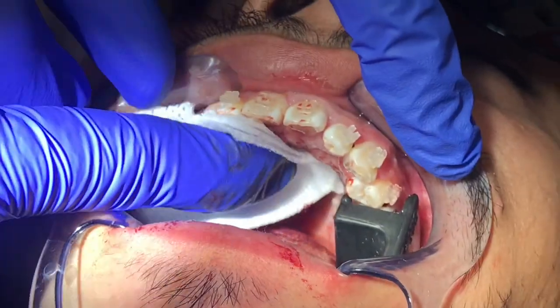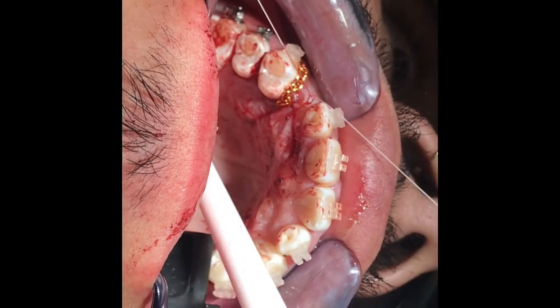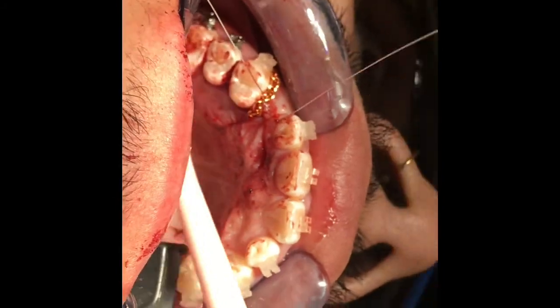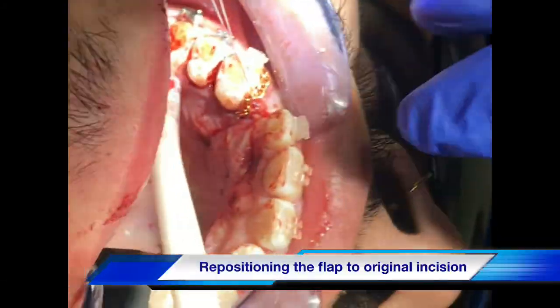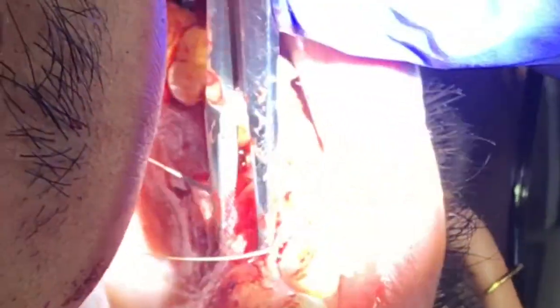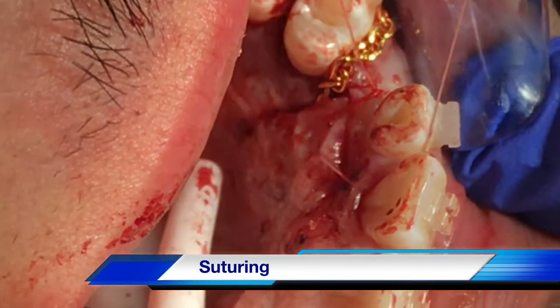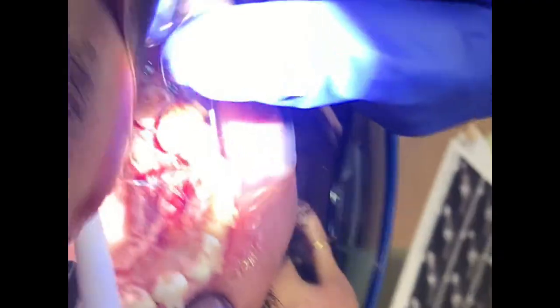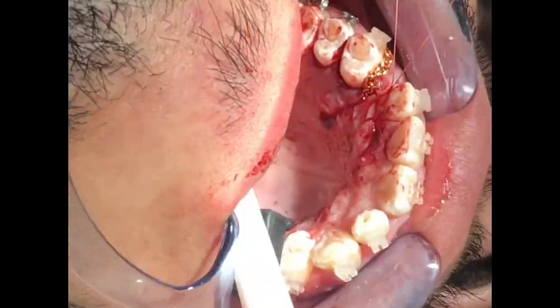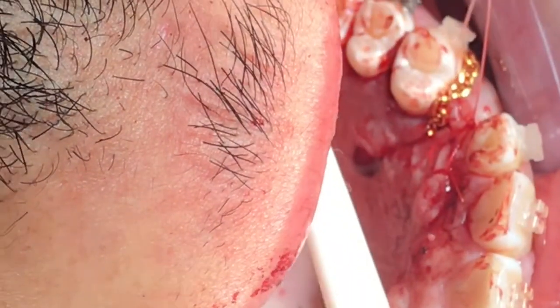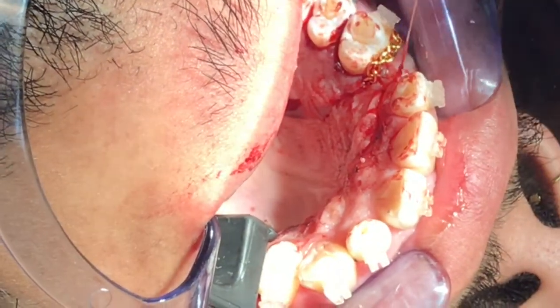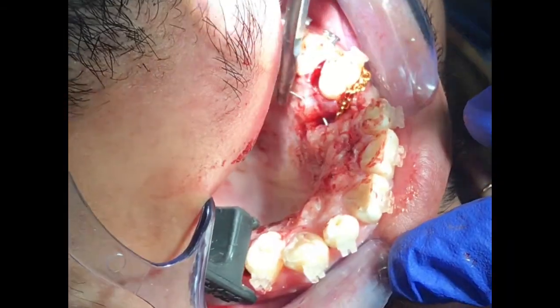Once the area is dry, we can attach the ball chains onto the canine and suture up the area. We want to make sure we have primary closure of this surgery, with minimum bleeding afterward and minimum swelling by well suturing.